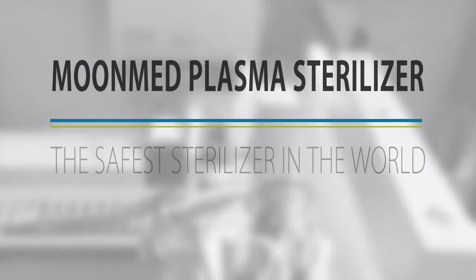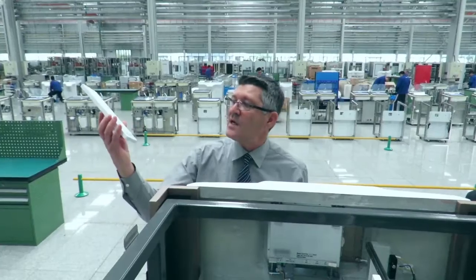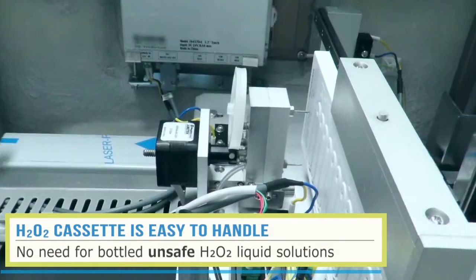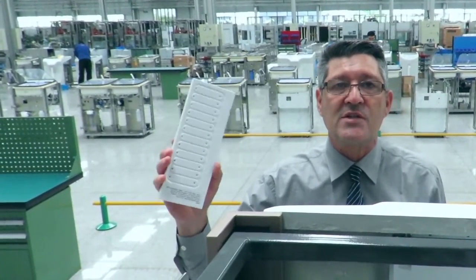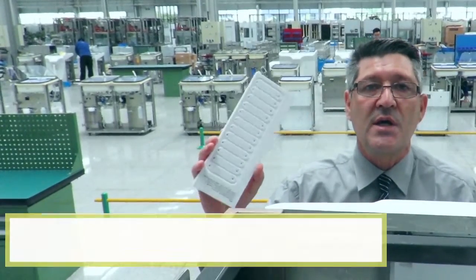The MoonMed Plasma Sterilizer is the safest sterilizer in the world today. This is a cassette which is used in the machine — it's hydrogen peroxide. I'm going to show you now how the machine works in the safest possible way, and why this machine is the safest machine in the world today.